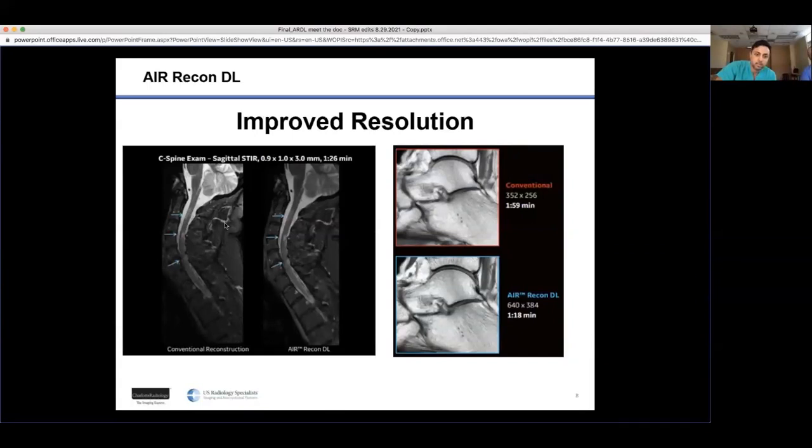With Recon, you can see these lesions a little bit better, as well as the cord signal, as well as the bone in the background. This one may be a little more subtle, but you see a conventional image acquisition, and then with the Recon, you can see the trabecular network and the cartilage surface better.